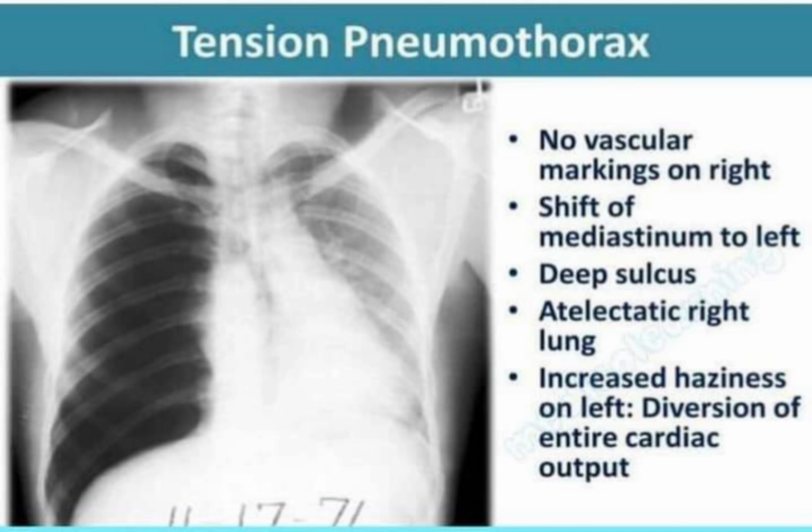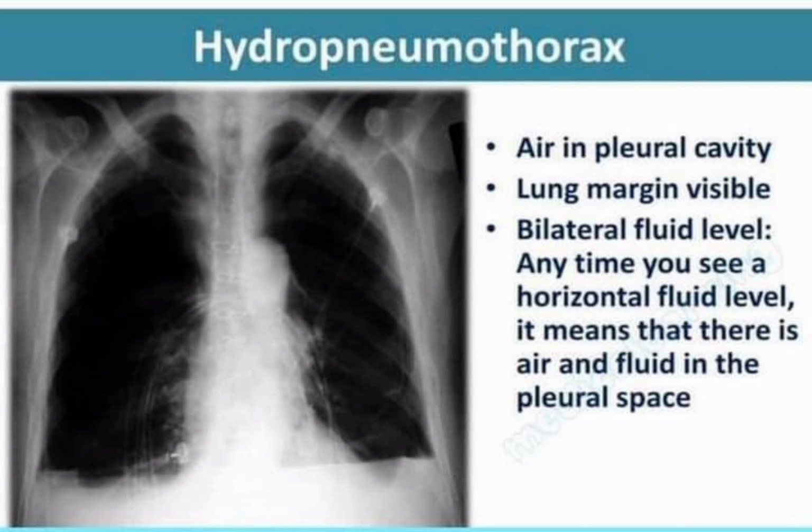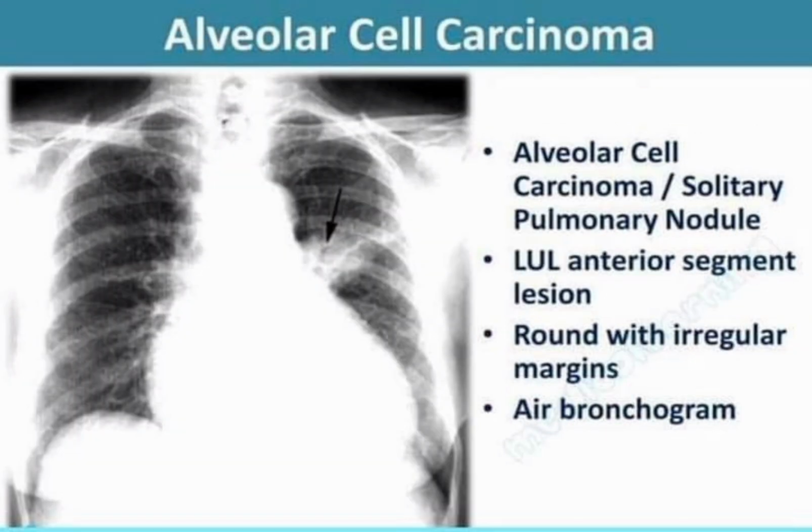Calcium deposits. Chest X-rays can detect the presence of calcium in your heart or blood vessels. Its presence may indicate fats and other substances in your vessels, damage to your heart valves, coronary arteries, heart muscle or the protective sac that surrounds the heart. Calcified nodules in your lungs are most often from an old, resolved infection.